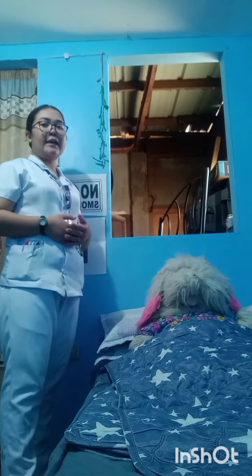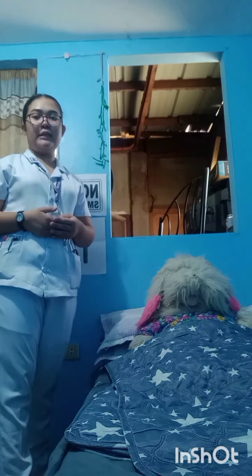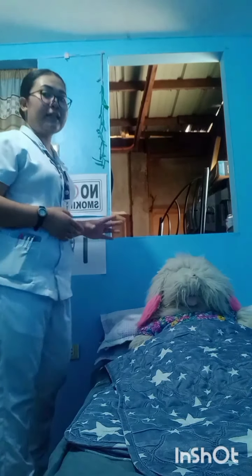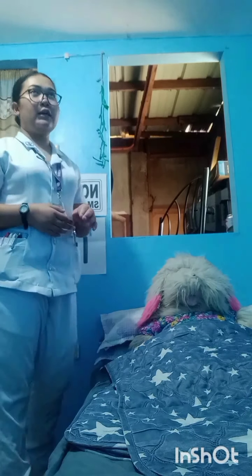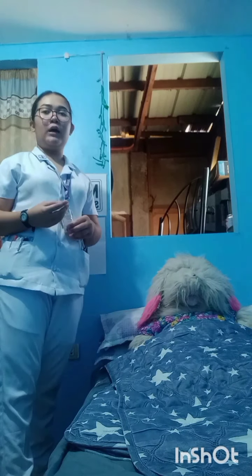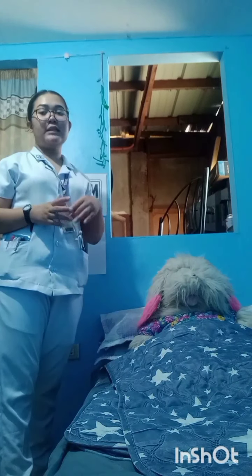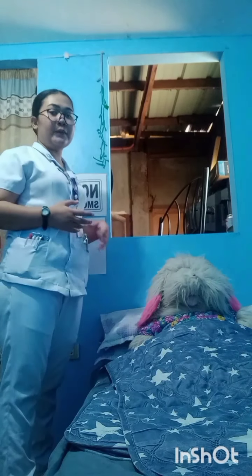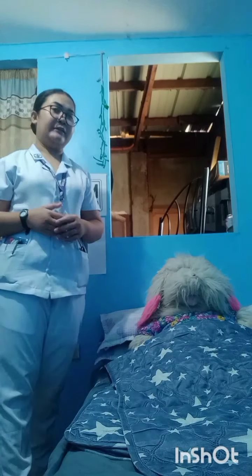Mostly ngayon, I can see in some hospitals here in our city, Davao City, mostly sa kanila ay wall outlet na. Hindi na kagaya ng mga oxygen tank, kasi mas mabuti ito kasi hindi na siya magagalaw ng iba, hindi na siya matutumba. So, mas less yung risk na matutumba or madidisgrasya yung pasyente natin.